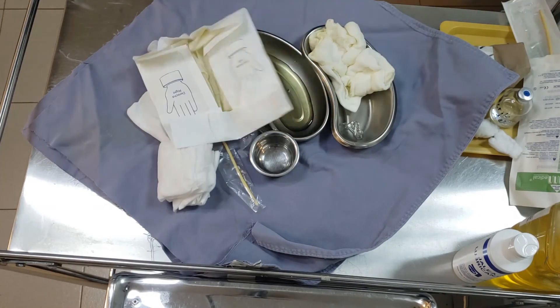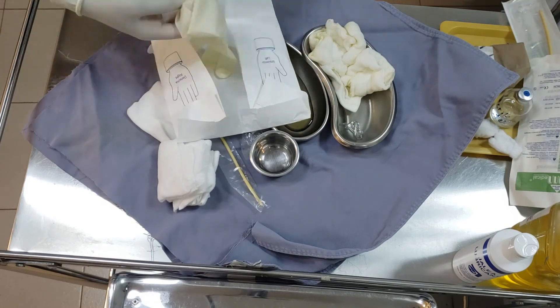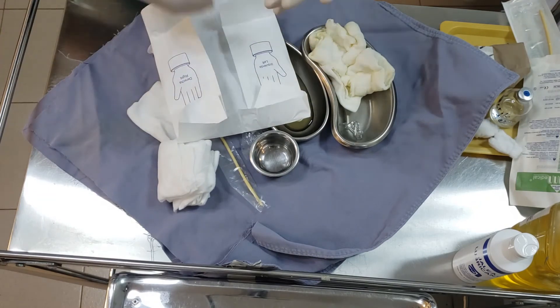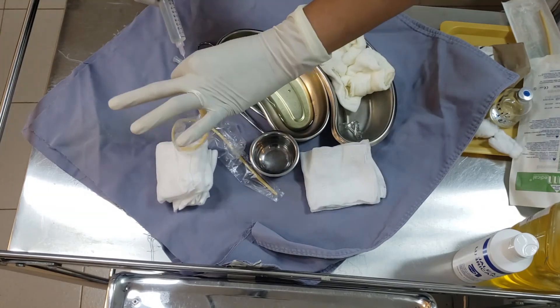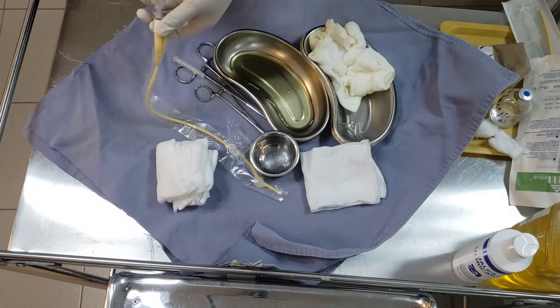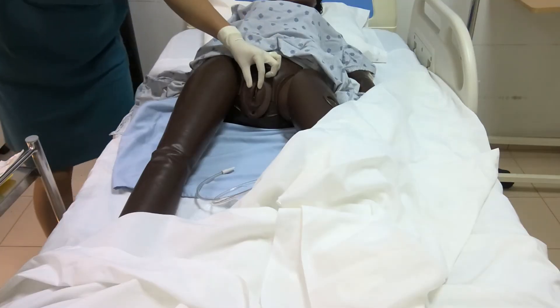Doff your glove and don new sterile gloves. Test the balloon of your catheter to ensure that there are no leaks. And clean the meatus.